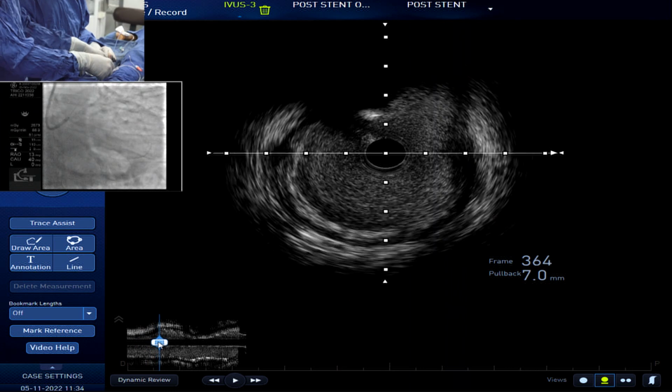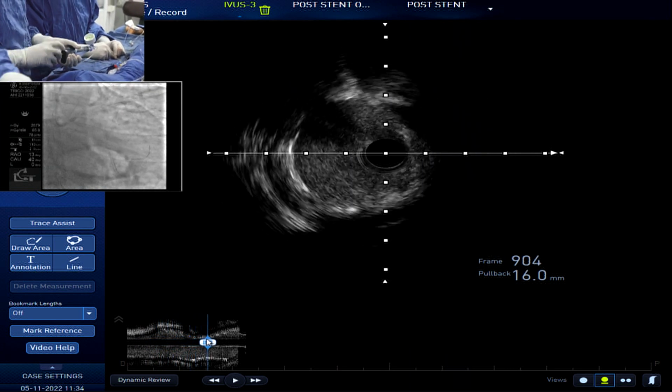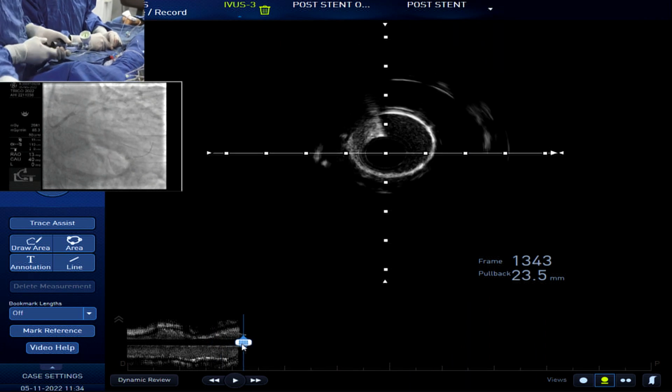Okay, here. We go ahead. Go. 12, 14. 40. High. Deflate.